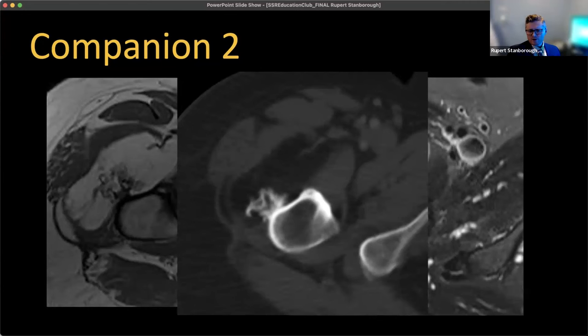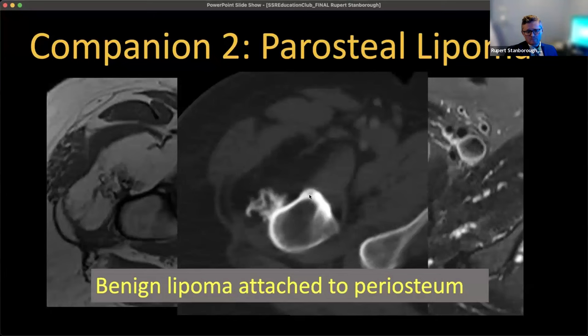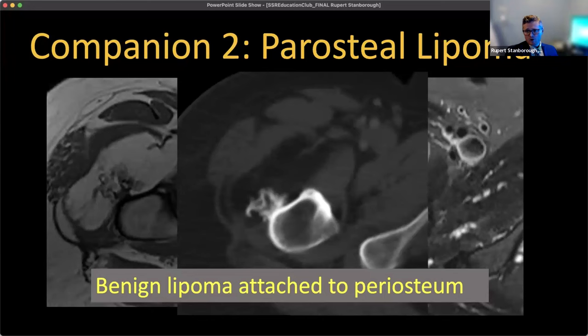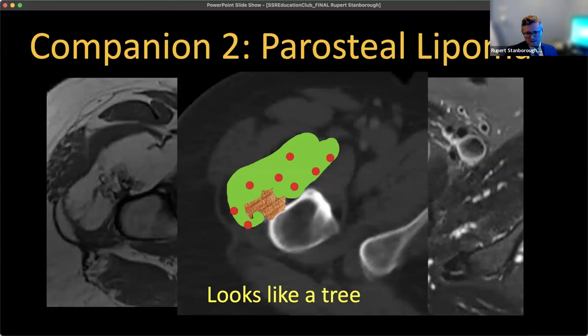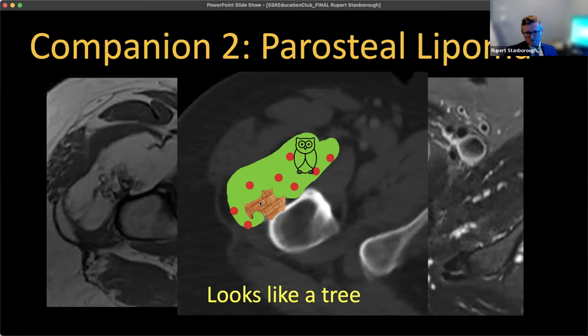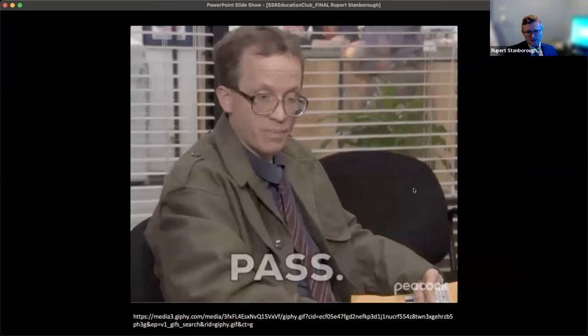The difference between this and an osteochondroma: with an osteochondroma, it's continuous with the cortex and marrow cavity. Here, we have cortical bone cutting off the marrow cavity — so this is not an osteochondroma. This is actually a little tethering of that periosteum. The diagnosis is a periosteal lipoma. People say it looks like a tree — the little piece of bone off the periosteum makes the trunk, and the fatty mass on top looks like leaves. These are benign findings.